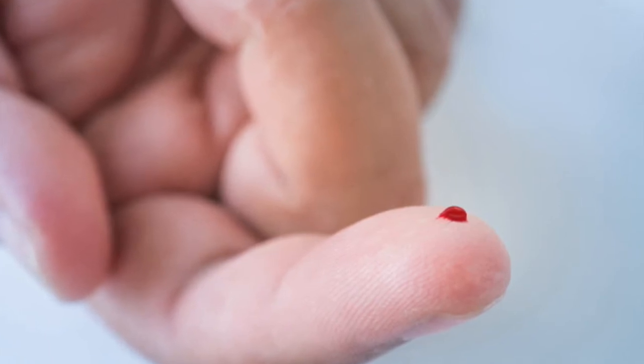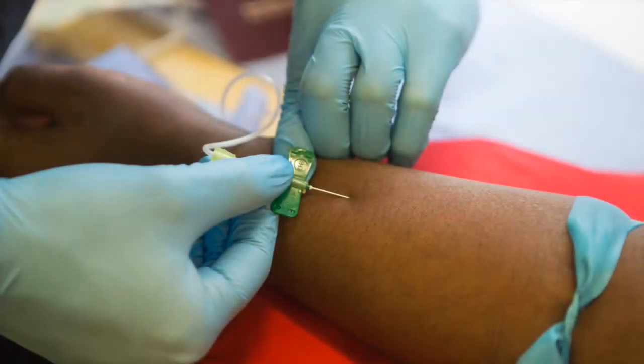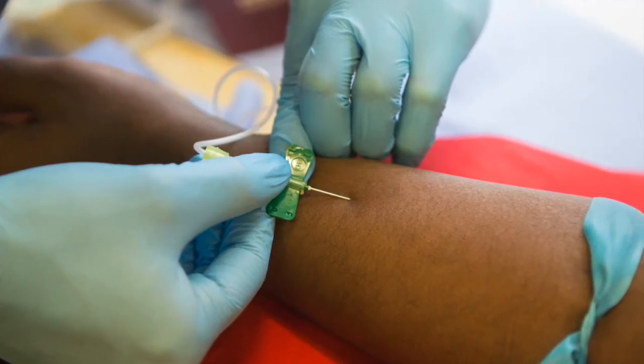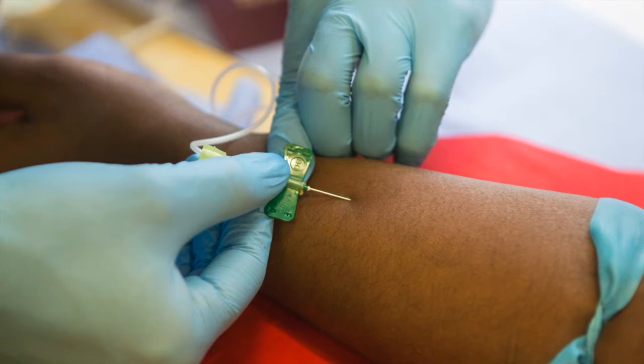And believe it or not, even if you have a peripheral IV in one arm and we have access to your vein, to get a blood sugar or a blood draw, we still have to stick you again, causing more pain and more risk for infection.